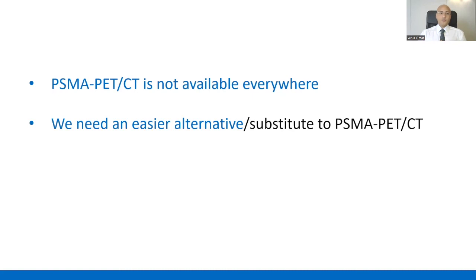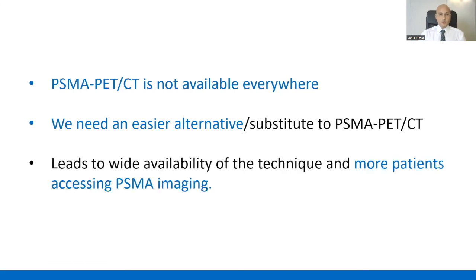So the question was, can we find an easier alternative or a substitute to PSMA PET-CT to avoid all the hassle for the patients traveling to access this imaging? And by doing so, through technetium PSMA, we can have a wider availability of this technique, and now more patients can access PSMA imaging easily. So that's the main idea behind why technetium PSMA. Wider access and easier for patients.